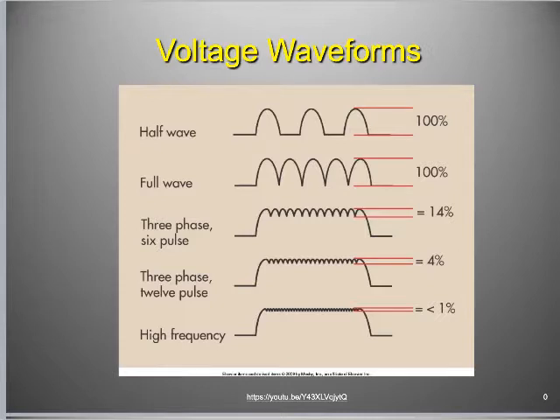There's other power implications that he talks about here in the textbook on page 139. This impacts contrast. I know that we haven't defined contrast yet, but if we see right here at the bottom of this paragraph, the last full paragraph on the left side of the page, this provides a higher overall penetration for the X-ray beam and more exposure to the detector plate. So anytime we see increased penetration, just know, for right now, just memorize this, it means decreased contrast. If we see increased penetration, it means decreased contrast.